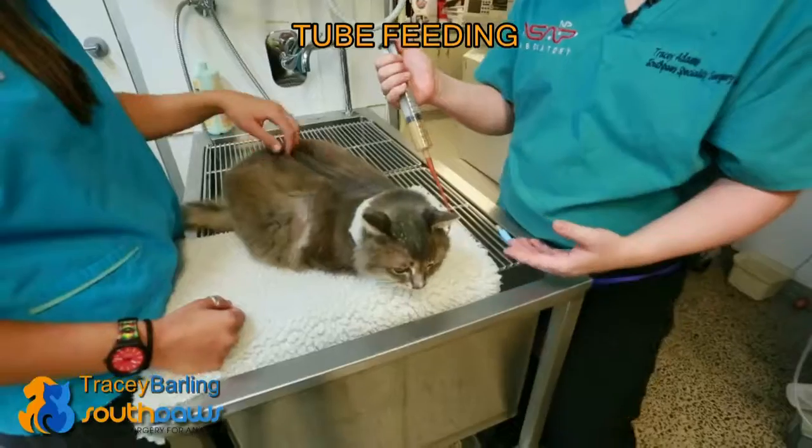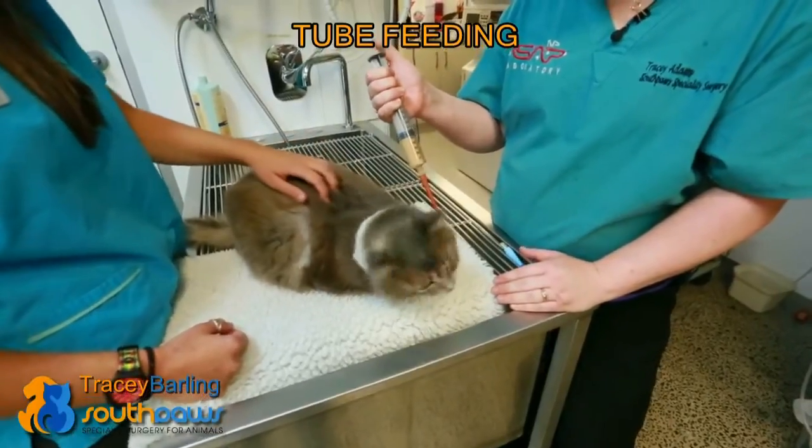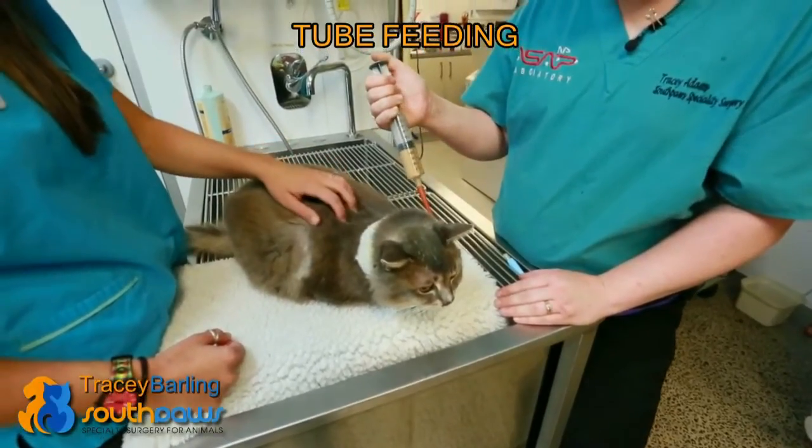If it does get clogged, you can actually use Coke — it has to be real Coke, not diet Coke or anything. The carbonation will help break down the food and flush it through the tube.